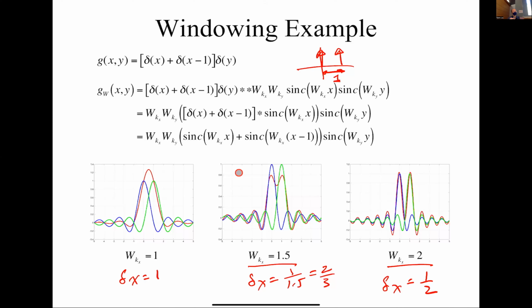So a lot of the rapid imaging, like compressed sensing, a lot of the impetus for that came out of pediatric radiologists. We're saying, hey, anything we can do to speed up the imaging time is good, because if you scan a child for 5 minutes, but they're moving for half the time, your image looks horrible.